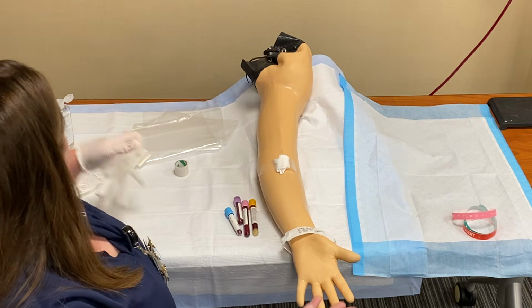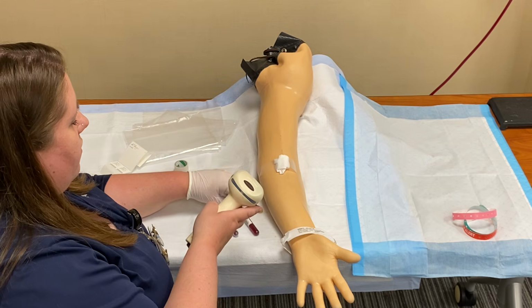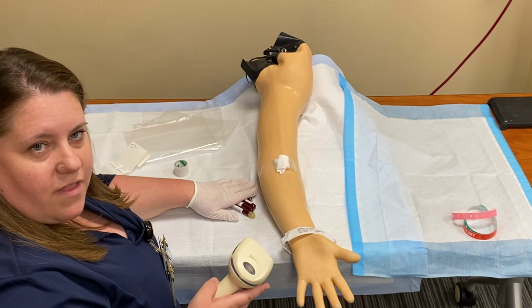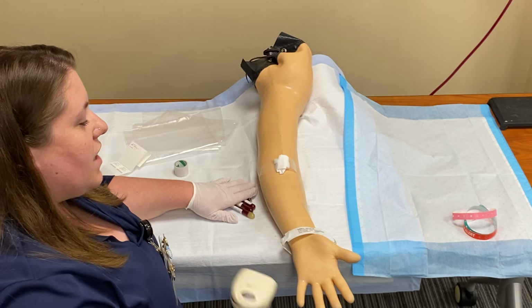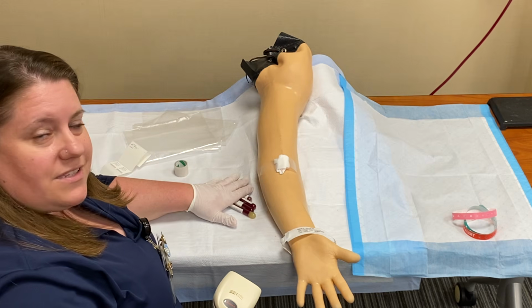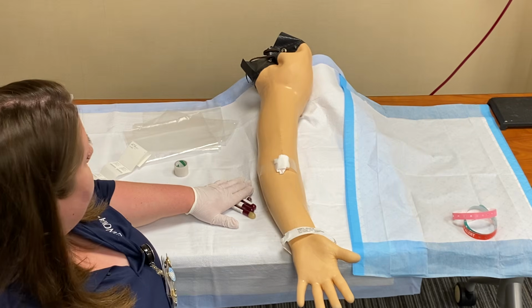Since I'm going to the computer, I'm taking one glove off, grabbing my scanner. I'm going to scan each tube. Beep, beep, beep, beep. So my specimens are collected, and I can see that on the screen. And then to finish the entire process, I need to scan the patient's bracelet. If I forget to scan her bracelet, the lab is not going to accept my sample, and I'm going to have to redraw. Beep, and I'll see that everything is completed.